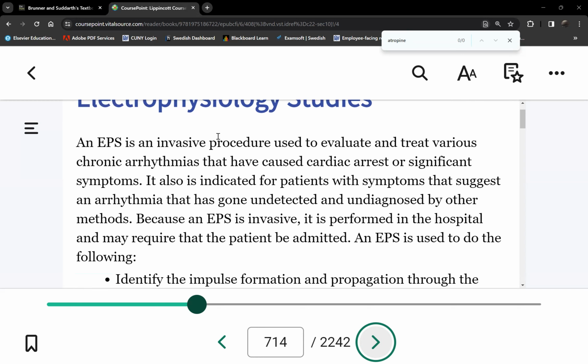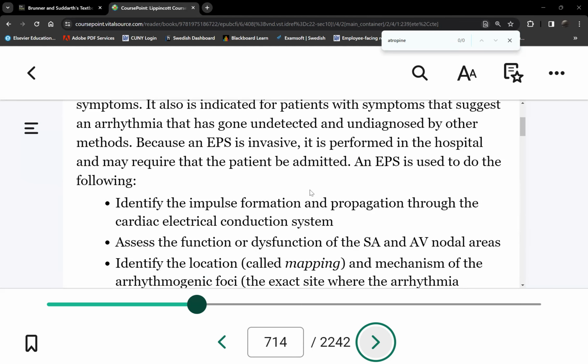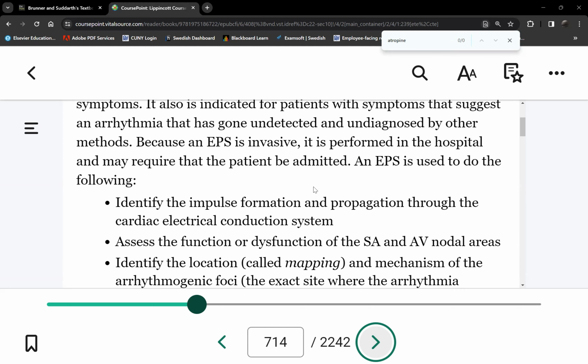Electrophysiologic study, here's the description: to evaluate and treat arrhythmias. So they will show the doctor where the locations are of the cells and tissues inside the patient's heart chambers that are firing the erroneous or pathologic electrical impulses. Okay, so once they're located, they will be targeted for destruction. What will the catheter ablation do? They will use electrical waves in order to destroy the cells. Okay, literally burn them, destroy those errant cells.